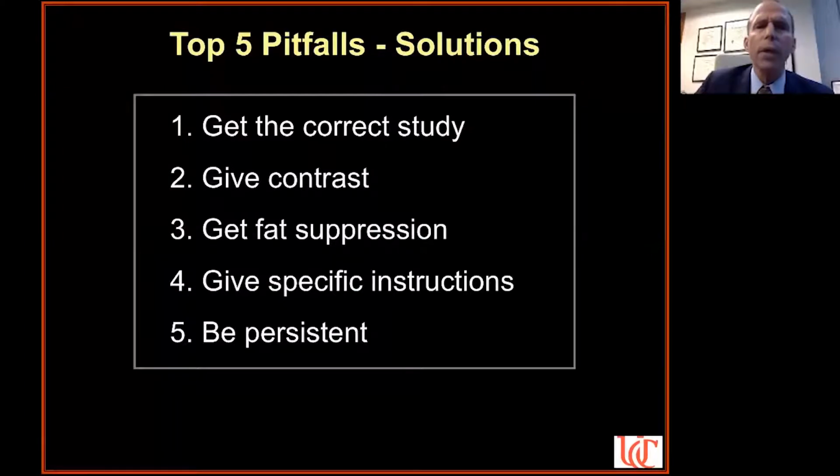So the top 5 pitfalls, or the solutions, are: get the right study, give contrast to everybody, get fat suppression. If you're interested in the orbits, get fat suppression. Give specific instructions and be persistent.